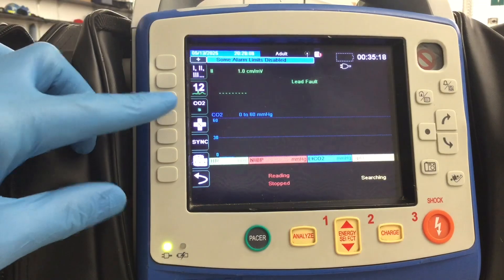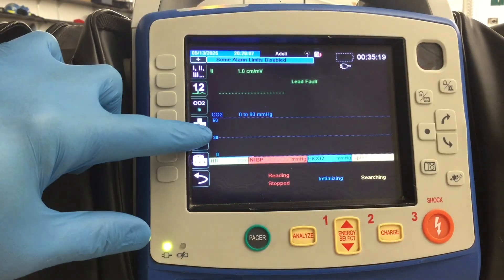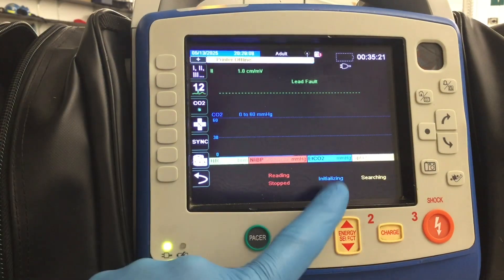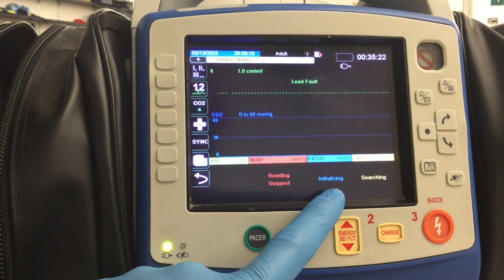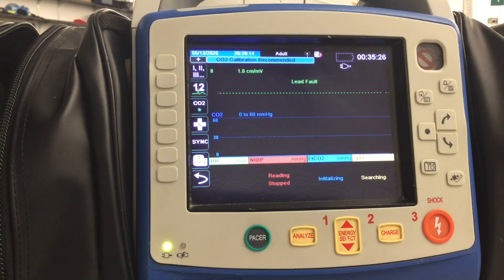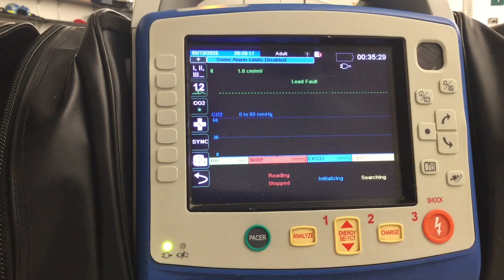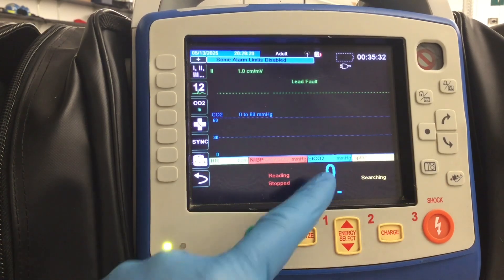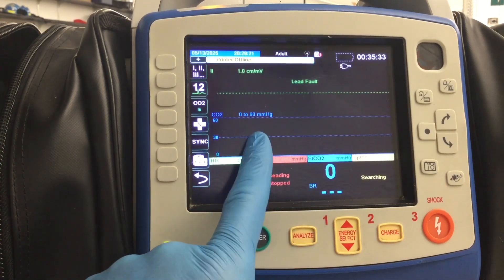This will light up on your screen and you'll see the lines for your waveform. Under numeric capnography it'll tell you it's initializing. Always zero and calibrate your monitor prior to applying it to the patient. When it's ready, you'll see that it's zeroed and indicated on the screen — it's ready to go.